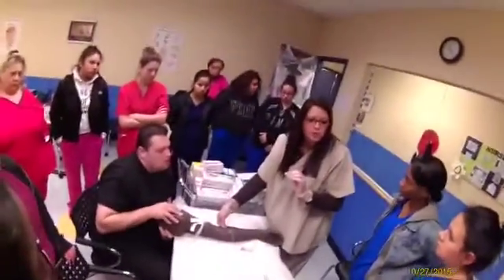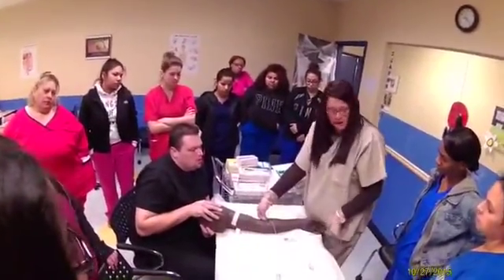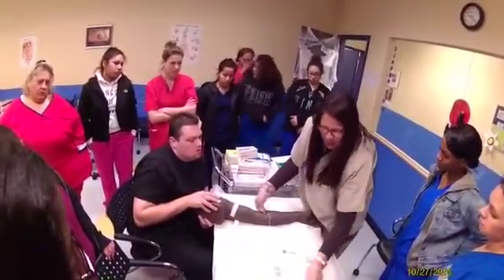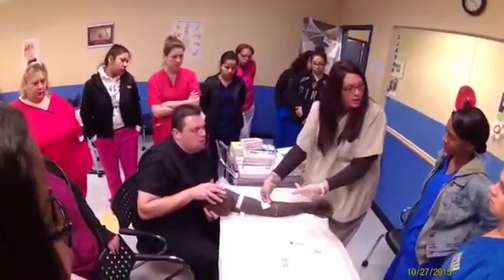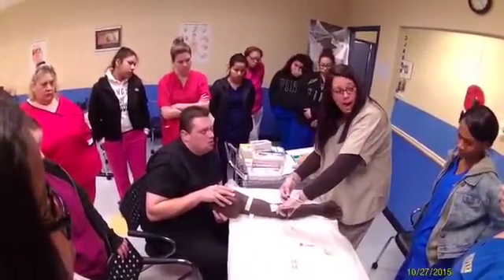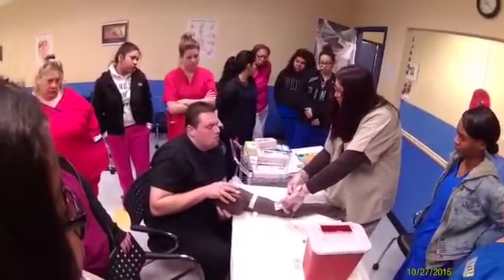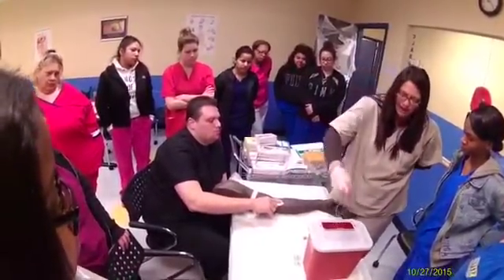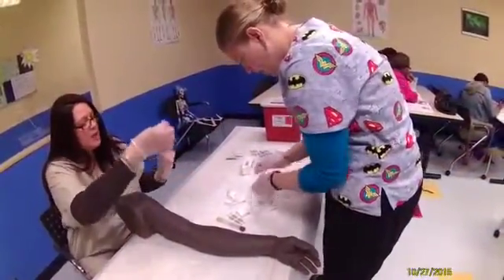I'm going to end my venipuncture procedure and it's always the same. Tourniquet — pop it off with one hand, right? Take our tube out. Gauze. I'm going to get my gauze and just lay it on top. I am not pushing — why? It's going to hurt because the needle's in there. So I'm going to lay it on top, coming straight out quickly the same way that I went into the vein. I'm going to ask my patient: please put pressure here.